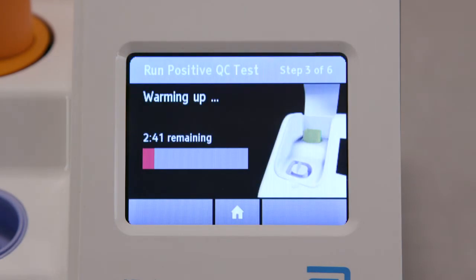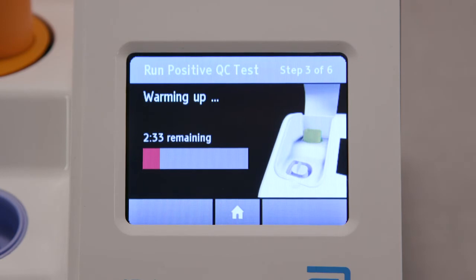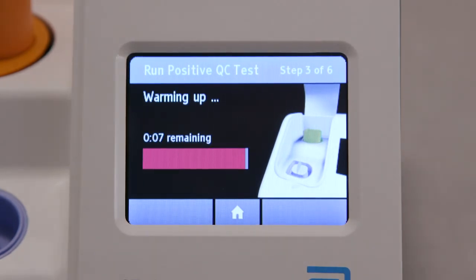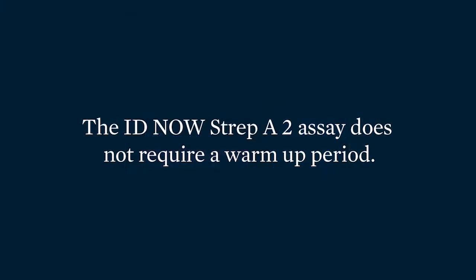Do not remove the sample receiver from the instrument once the warm-up has begun. Wait for the sample receiver to warm up. The IDNOW Influenza A and B2 and RSV assays include a 3-minute warm-up time after placing the sample receiver in the IDNOW instrument. The IDNOW Strep A2 assay does not require a warm-up period.